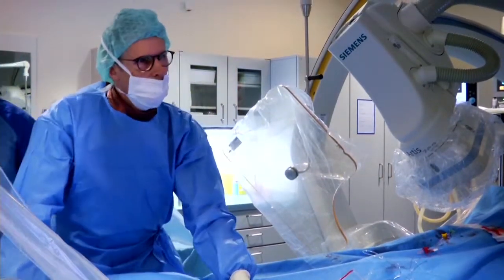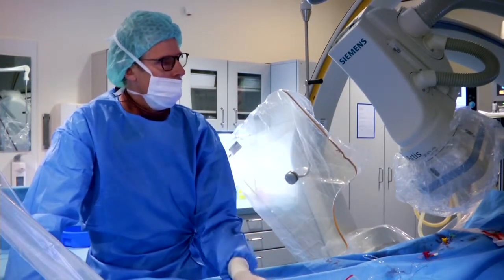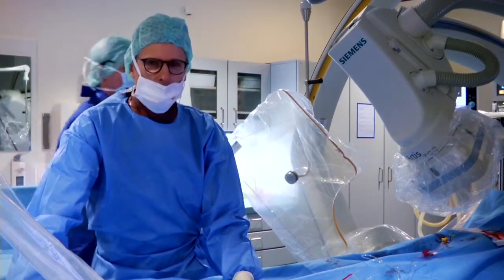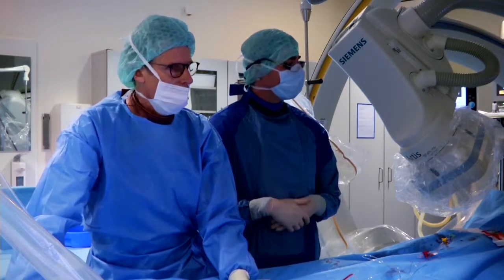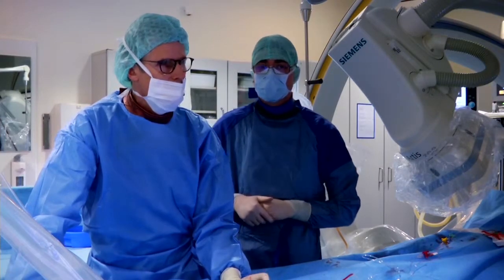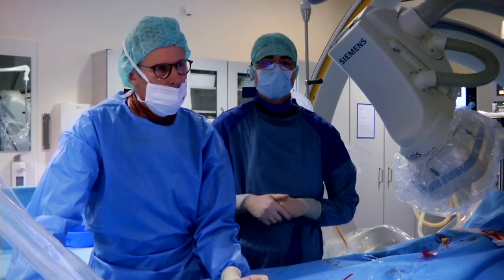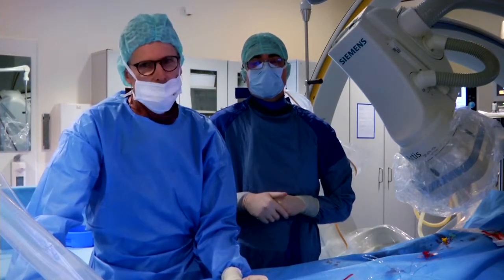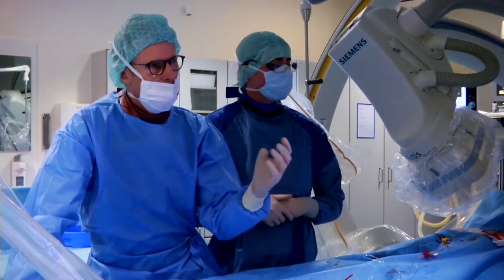Right. When we implanted the stent, we dilated the subclavian artery through the struts. But when you have a look at the first angiography on the A, perhaps, then you see that there is obviously a double supply from the vertebral artery and from the direct way from the descending aorta. So the subclavian artery is really large, and it's only the connection which is a little bit tiny. I think at the moment where we disrupted the intima, we just would like to avoid it, because at this point it's only cosmetic. You can make it a little bit larger, but as you see, the subclavian artery fills and refills.